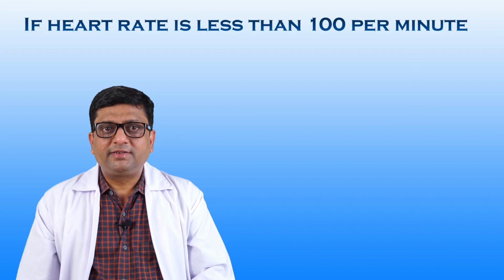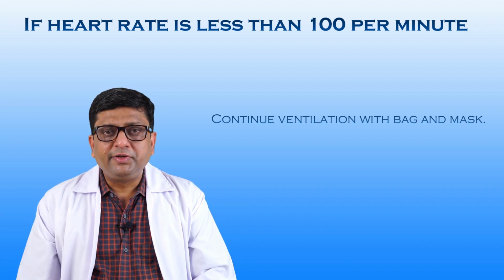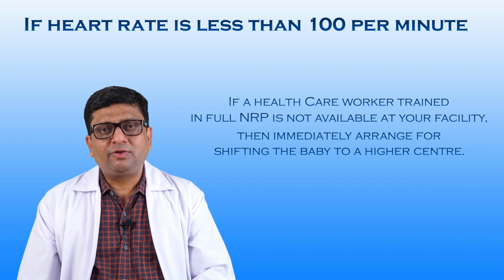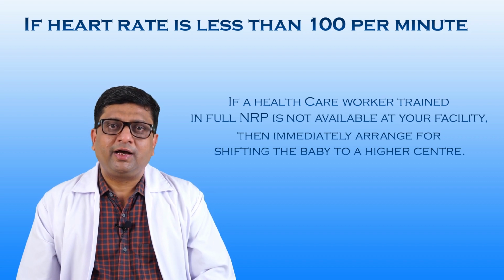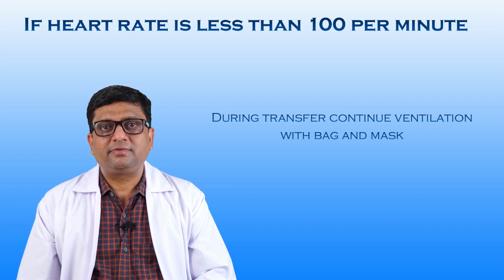If the heart rate is less than 100 per minute, ensure chest rise, and if necessary, again take corrective steps for ventilation. Continue ventilation with bag and mask. If a healthcare worker trained in full NRP is not available at your facility, then immediately arrange for shifting the baby to a higher center. During transfer, continue ventilation with bag and mask.